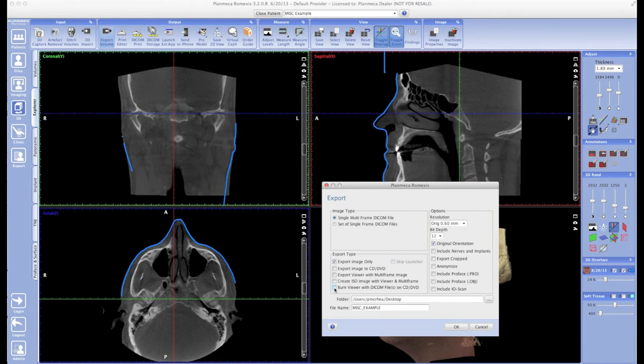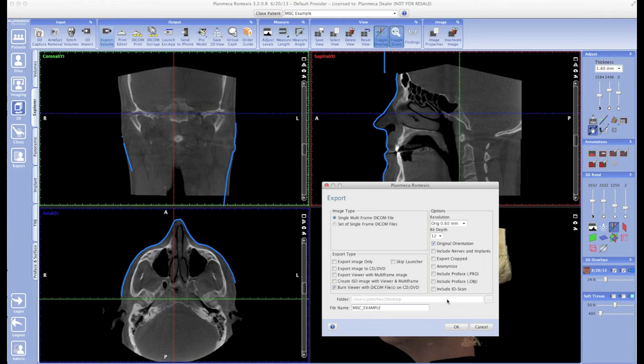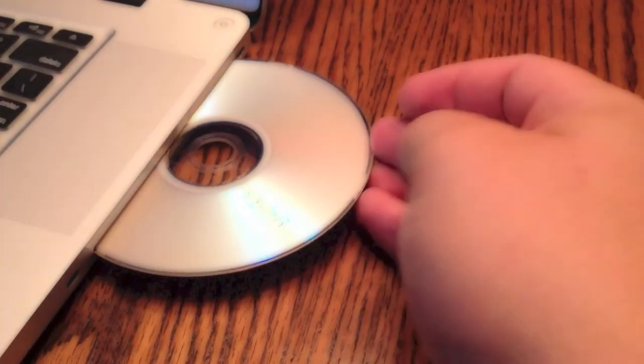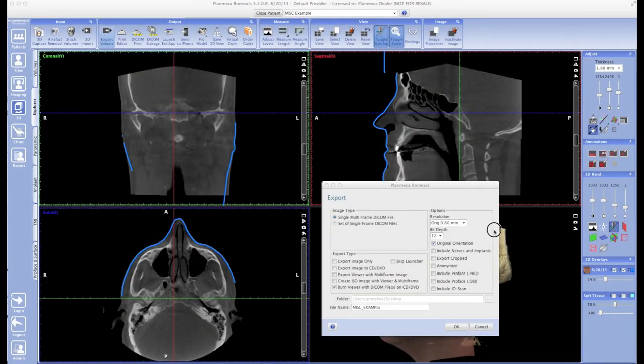At this point, we can name the file anything we want and then click OK. Immediately, Romexis will start to look for that blank DVD, it'll start preparing the volume and the viewer for export, and it will go ahead and burn that information to the disc.